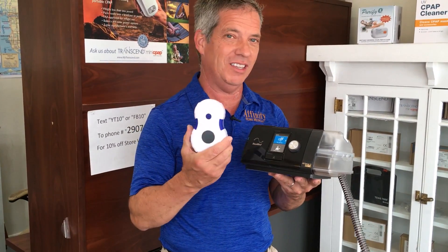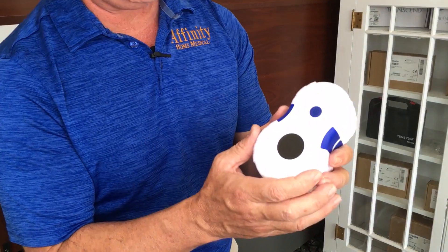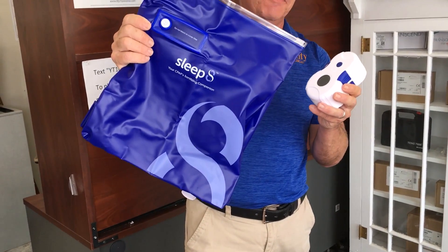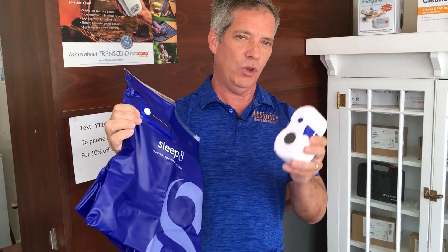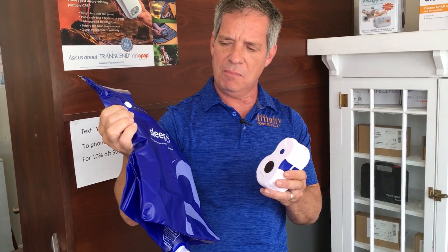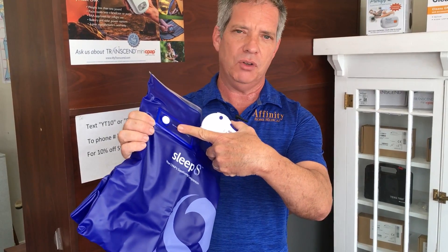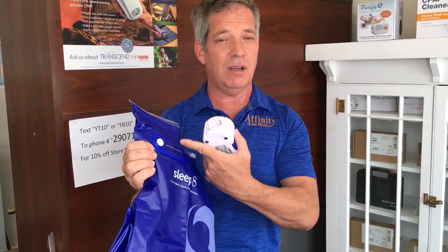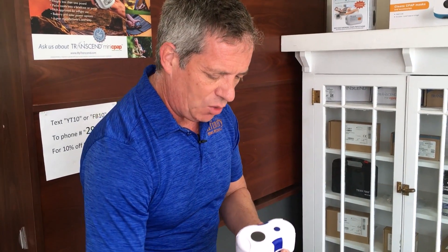Now let's do the AirSense 10 with the Sleep 8 CPAP cleaner. When you purchase a Sleep 8, you get the Sleep 8 machine, the charging cables, and this really huge Sleep 8 bag. The great thing about this bag is that you can get your CPAP mask, your hose, and your water reservoir all into the bag with one cycle of cleaning. You have to get a new bag about every three months, roughly, and there is a cost involved, but it's not too terrible. There's a charcoal filter built onto the bag so that when the ozone escapes, it converts back into regular oxygen, which is really valuable.